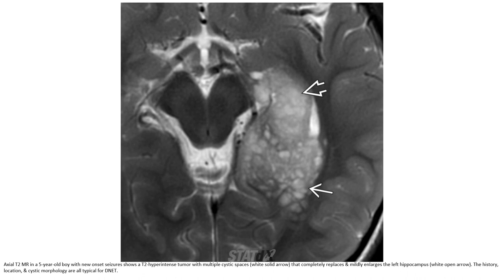T2 MRI of a 5-year-old boy with new onset seizure. T2 hyperintense tumor with multiple cystic spaces that completely replaced and mildly enlarged the left hippocampus. The story, location, and cystic morphology are all typical for DNETs.